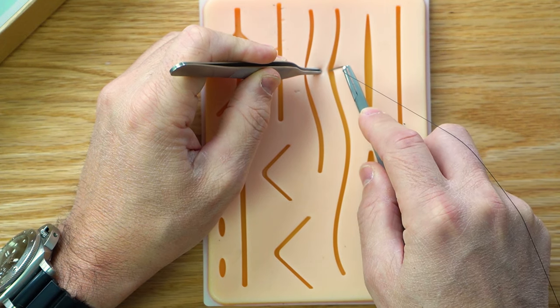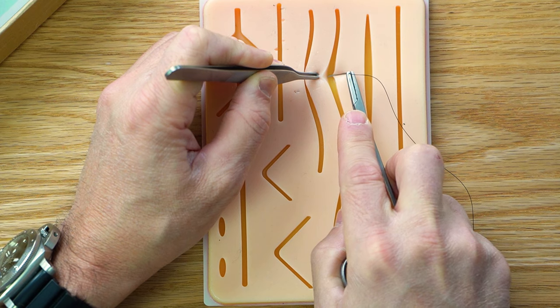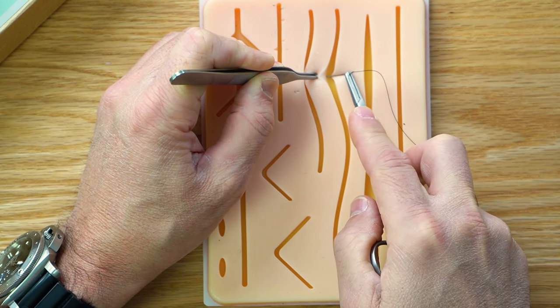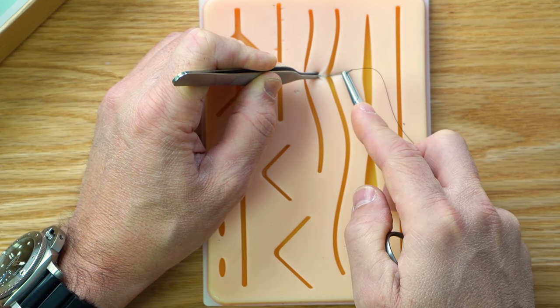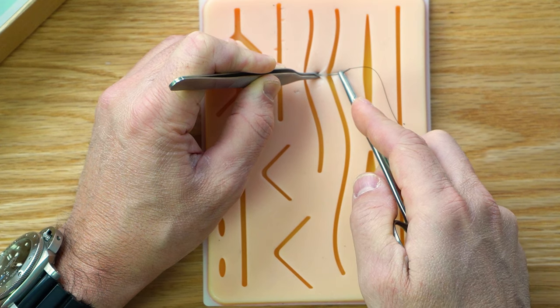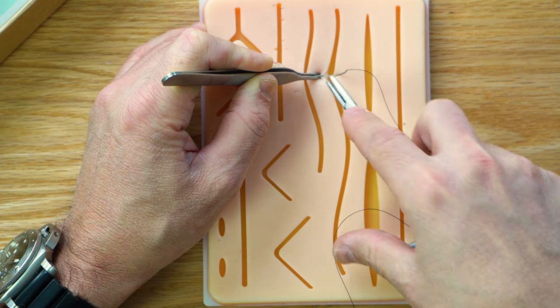What you're going to grab here is, I'm gonna try to have you guys see this. So what you're gonna do here is you're gonna go under. Now this is going to be almost like under the dermis layer, okay? And you're going to pick it up, and it's going to come out of the dermis layer and not in the epidermis layer. So as you will note, I'm going the opposite side of my right hand, okay?